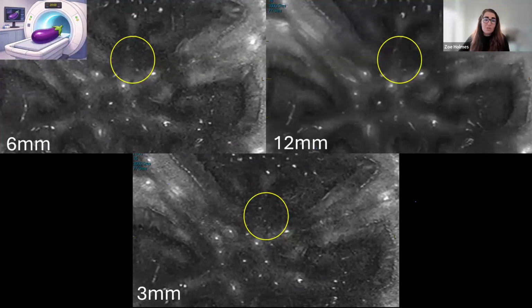But what are the consequences of going rogue and doing really big slice thicknesses? This slide reinforces the partial voluming that can happen. Thick slices are like taking a photograph with a motion blur in the slice direction, so different layers of anatomy are being blended into one measurement. This blending can mimic pathology or hide it.